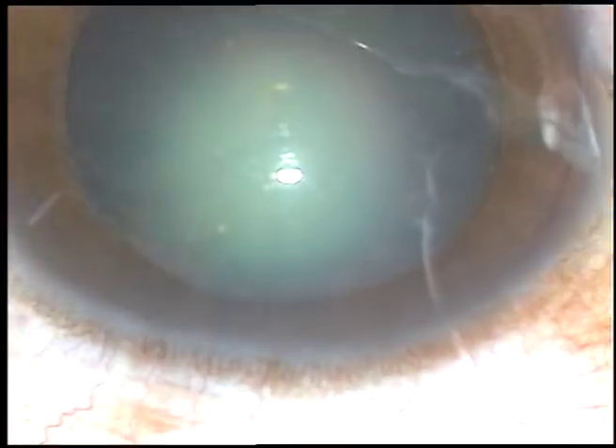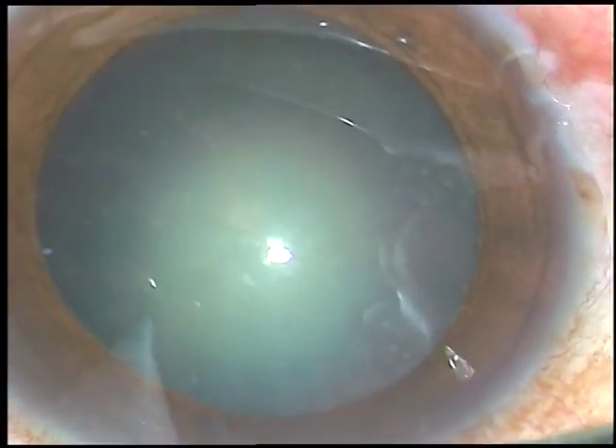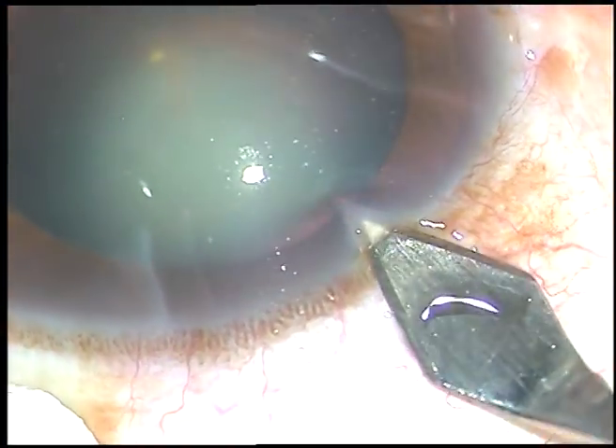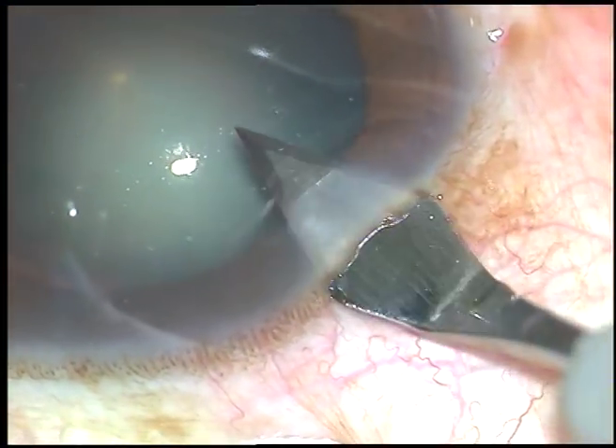Dear colleagues, this surgery has been done and recorded to teach the steps of phacoemulsification of the cataract with grade 3 nuclear sclerosis.